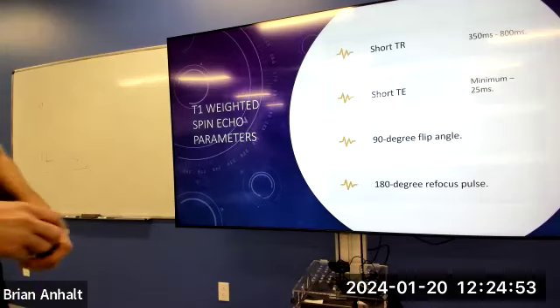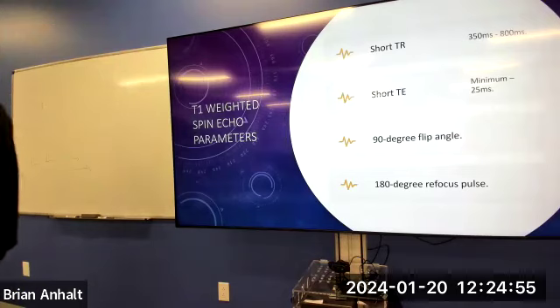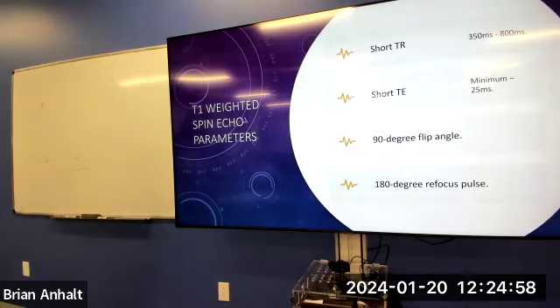Write these down because I am going to give you TRs and TEs, and I'm going to say, hey, what kind of weighting is this? There's going to be some questions on your next quiz.